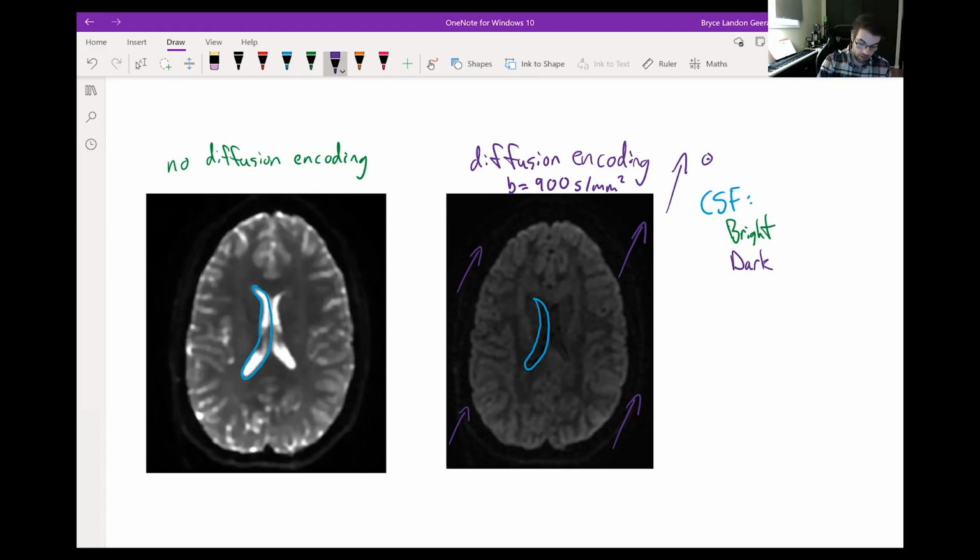Whereas in something like the corpus callosum, which I'm going to do in orange. So let's just look at the front of the corpus callosum, the genu. If you're not familiar, this is the main connective tract between your hemispheres. In the brain, it's proceeding most of its fibers from left to right. So in our T2 weighted image, it's kind of a dark gray because T2 is faster in fatty tissues, so signal is lost there more quickly and becomes gray in our T2 weighted image. Whereas in the diffusion weighted image, it's actually lighter.